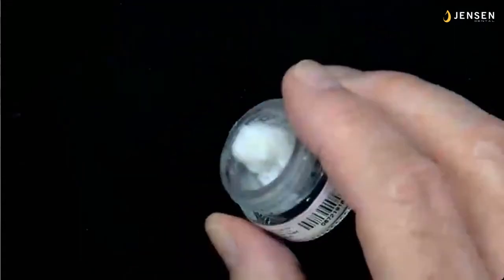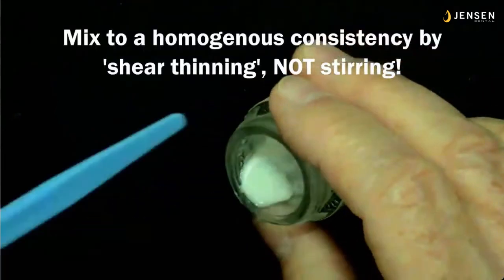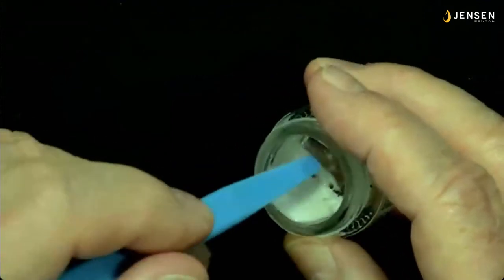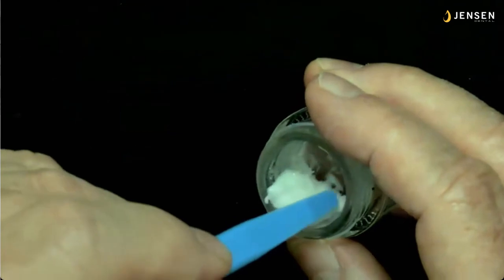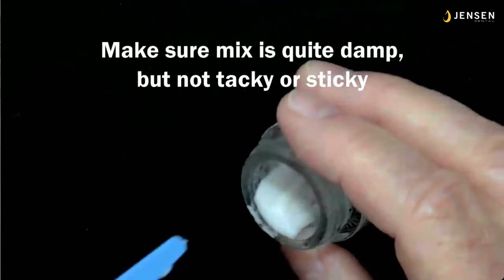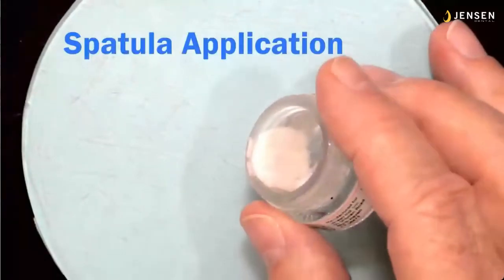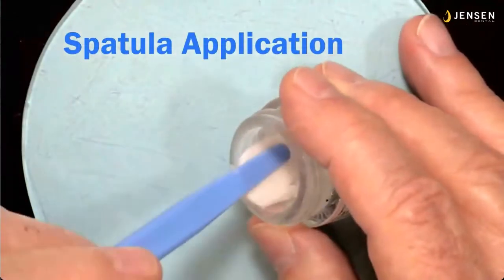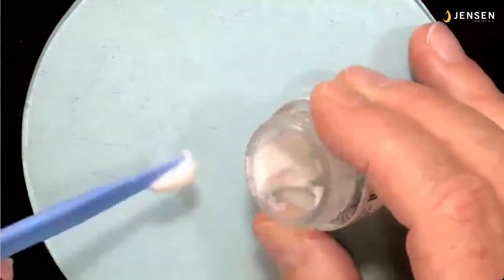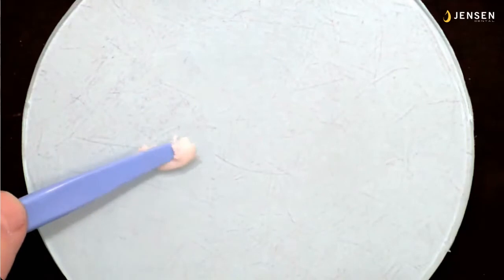So with a non-metal spatula, we're going to use shear thinning, which is patting it. So basically, think of squeezing a damp sponge to get the moisture in the sponge homogeneous throughout the sponge. So I'm patting this, making the moisture come up to the surface. But I don't want to stir it because it would get air bubbles in it, and air bubbles will look like little pearls because they have a different refractive index. So you want to keep air bubbles out of it. So with a spatula application, I take some out. Now this is a glass slab that has a little piece of blue paper put under it.